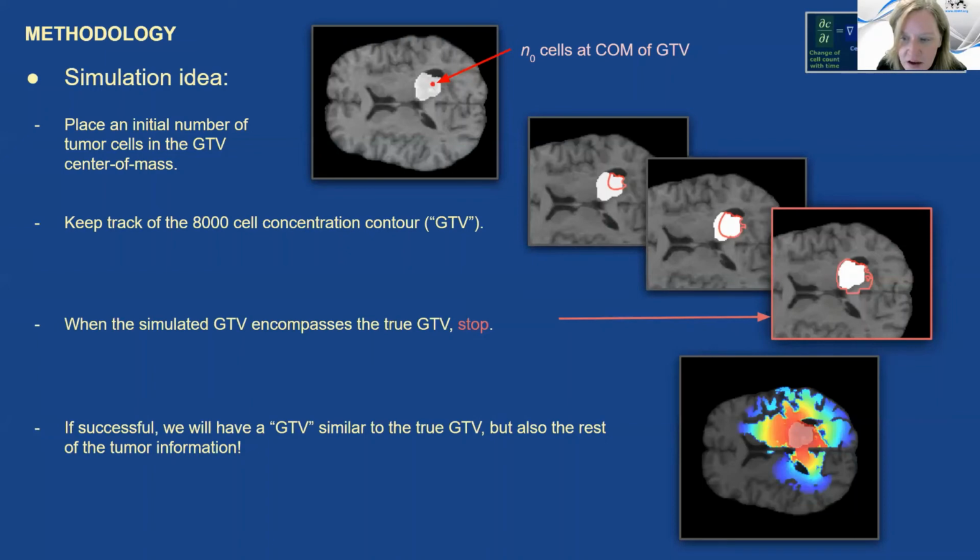Could you comment on the impact of different imaging devices for target visualizations? For example, which MR sequences are critical? Could radiomics potentially help with validation? So this becomes a matter of how to segment the tumor automatically.